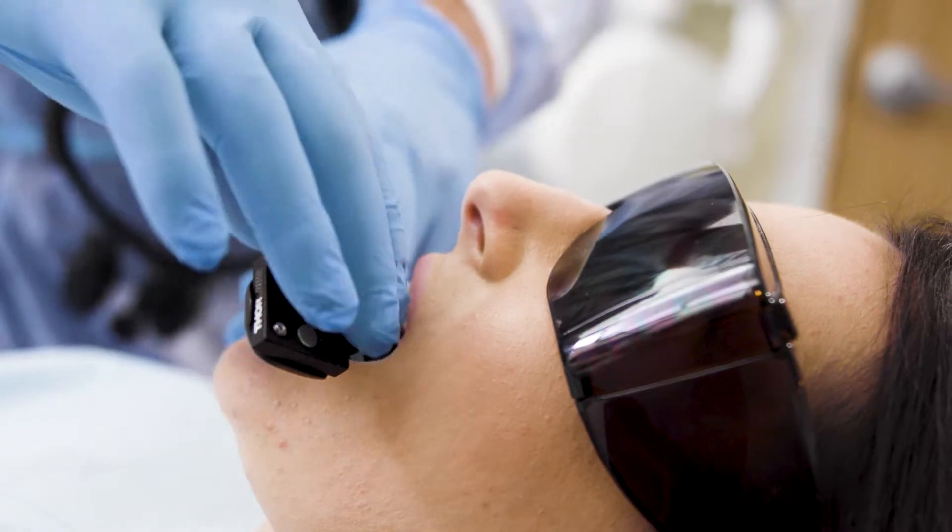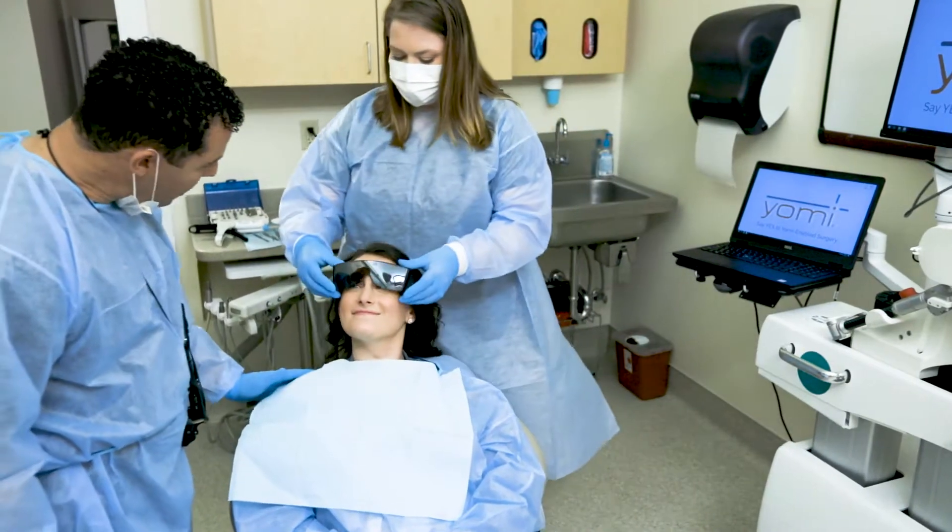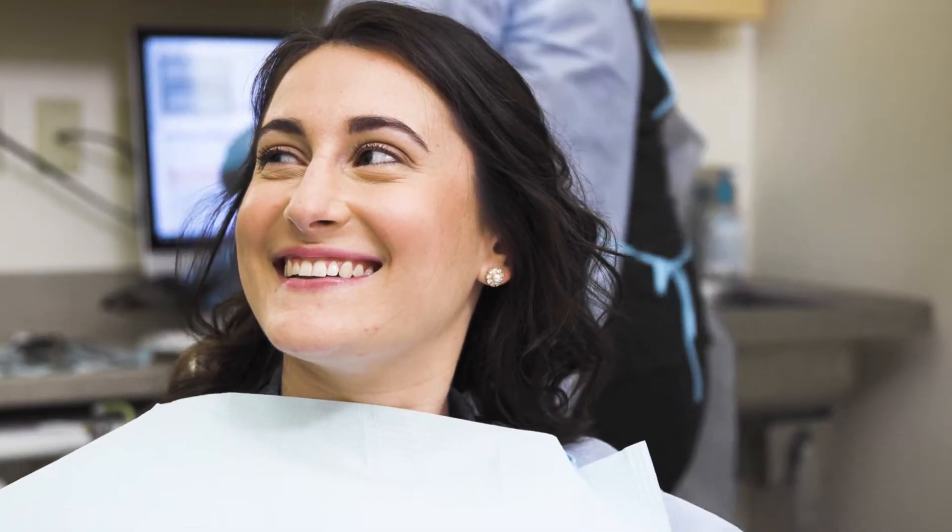Once we're done with that, we close up the procedure, remove the splint from the patient, and then go over post-op instructions. The whole thing generally takes under an hour to do.